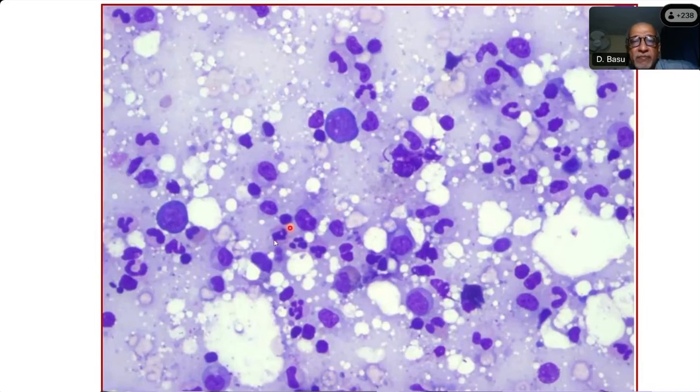In the rest of the field, neutrophilic maturation is also seen. Basically, a lot of myeloid cells with proper maturation right up to the stage of neutrophils, right? Occasionally eosinophils. And there are these couple of erythroid cells. So which stage of erythropoiesis is this? This is pro-erythroblast maybe, sir. These are roughly this large. This is the slide that was given to you, right?